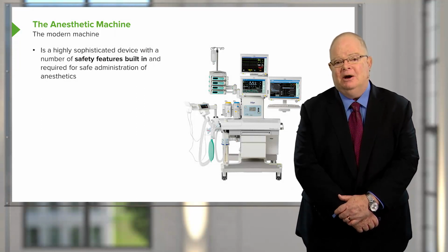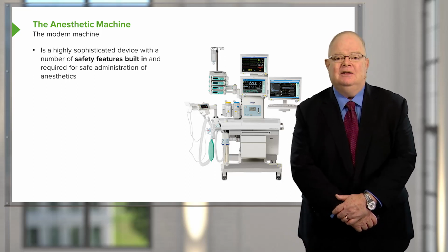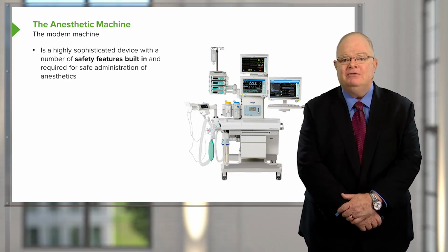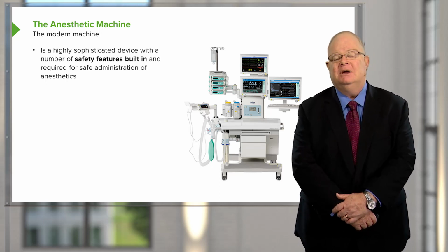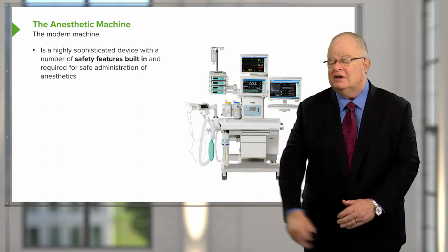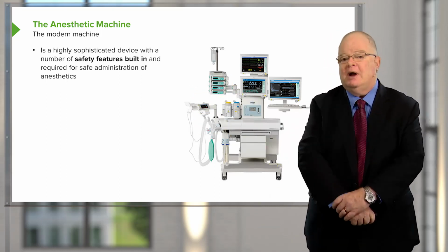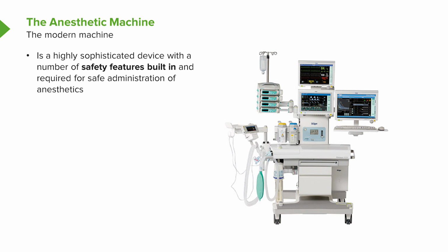Some people compare anesthesia to piloting a plane. This is our cockpit. In the anesthesia machine, there are many valves, there are many pipes, there's a high-pressure gas system, there's a low-pressure gas system, there are vaporizers, there are monitors, as you can see on the device, and on the pole that comes off the right-hand side of the device, you can see infusion pumps. Down in the lower part of the device where you can see pipes and the greenish colored bag, that's the circle system, and that's really what's responsible for our way of delivering anesthetics.